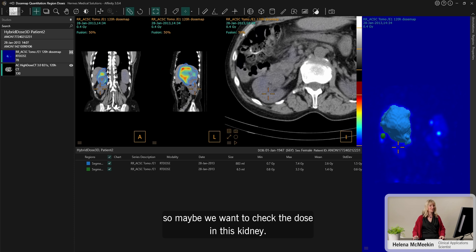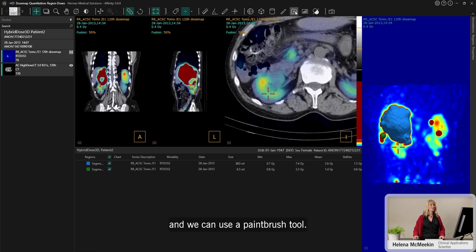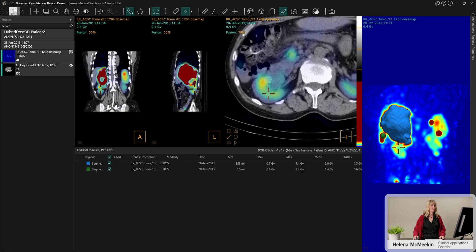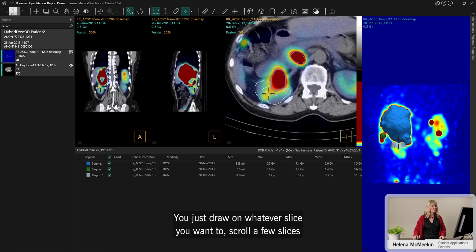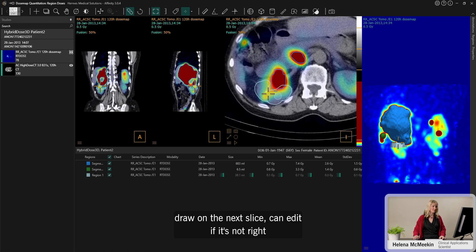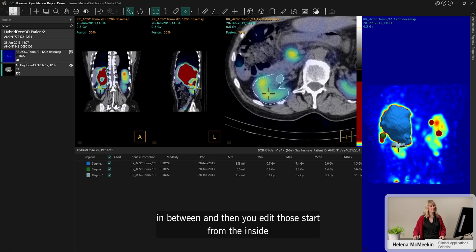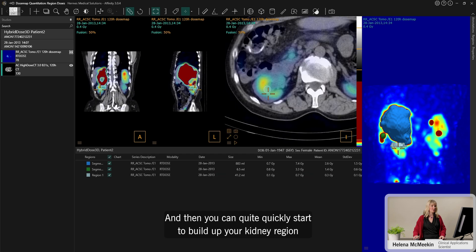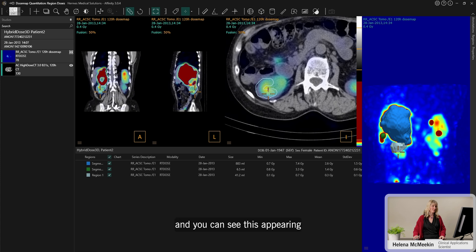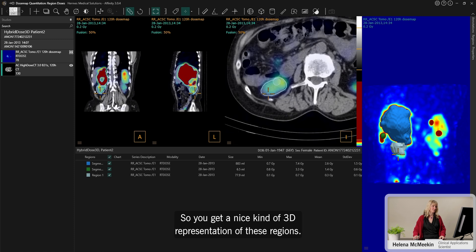Maybe we want to check the dose in this kidney. Let's just window it down so we can see a little bit there. We can use a paintbrush tool — let's just activate this paintbrush and start drawing. It's a really easy tool to use. You just draw on whatever slice you want to, scroll a few slices, draw on the next slice, and you can edit if it's not right. Then it interpolates the other slices in between. You can start from the inside to add, start from the outside to take away. And then you can quite quickly build up your kidney region. You can see this appearing not only on the other views, but also on the MIP as well, so you get a nice 3D representation of these regions.